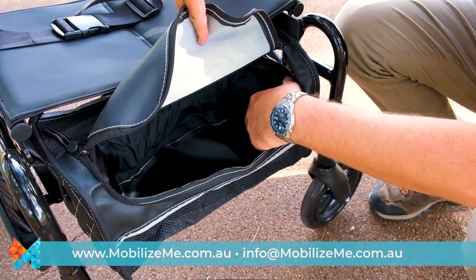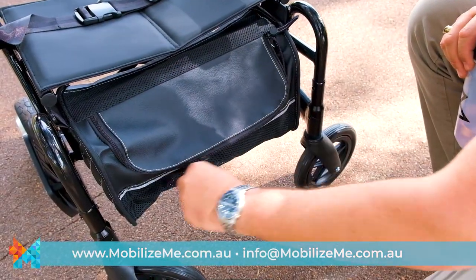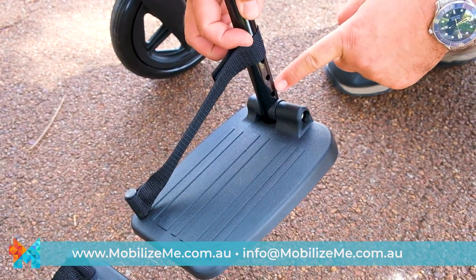The lithium battery is located in a pocket of the under-seat storage bag, leaving plenty of room to carry other items securely. The footplates are height-adjustable for maximum comfort.